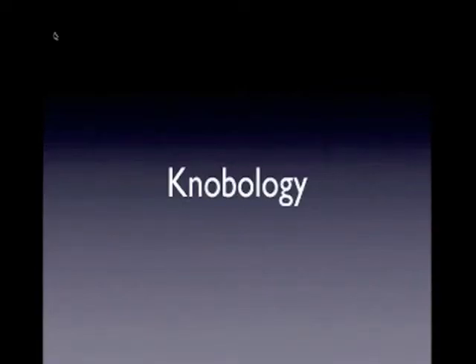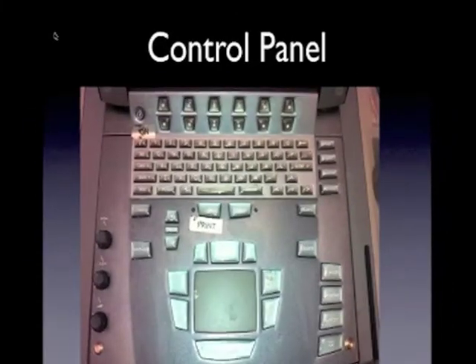Now that we've reviewed basic physics, let's discuss knobology. There are many different buttons on the control panel of ultrasound machines, and initially the number of buttons can seem overwhelming. Let's review the most important buttons on the next few slides to improve your understanding of ultrasound.